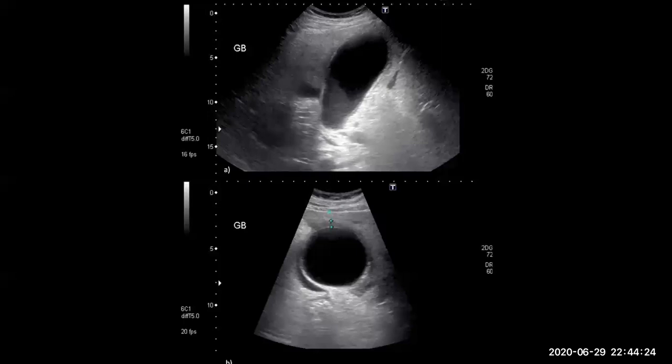Sure, in the ICU unit, but how to confirm that it is acalculous cholecystitis? From the history, MRCP? MRI will not add anything. You have gallbladder wall thickening and fluid, etc. You should do nuclear medicine. It is more definite than the other modalities. Okay? What do you see in nuclear medicine, by the HIDA scan? Delayed uptake in the gallbladder, no filling, while you see the tracer going to the biliary system, okay? This is the case.